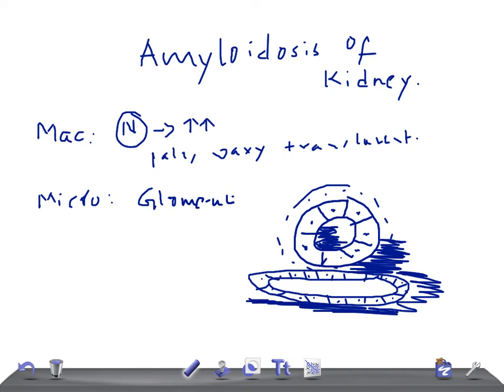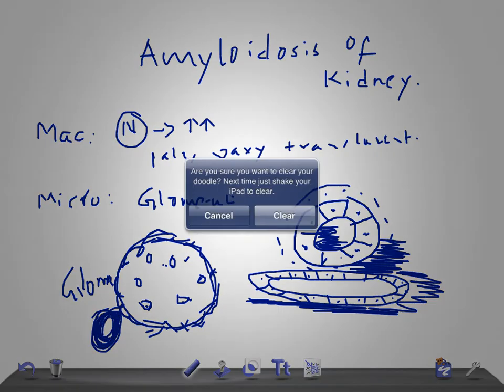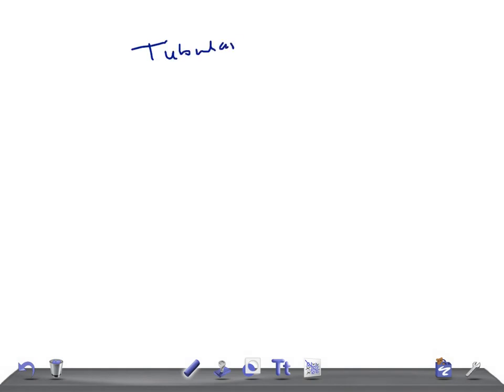The glomerular deposits — if you look at the glomeruli, you can see the cells and the glomerular deposits there. Amyloid also deposits in the blood vessels, causing narrowing. The amyloid deposits in the tubules begin close to the tubular epithelial basement membrane. These deposits may produce degenerative changes in the tubular epithelial cells and amyloid casts in the tubular lumina, as seen in the images.